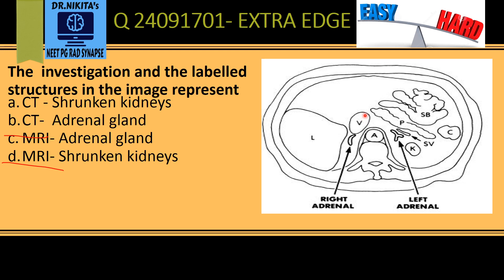To the right of the aorta is the IVC. Just posterior to that is the right adrenal gland, and we have the left adrenal gland here. The adrenal can look like a linear structure like this, or it can have an inverted Y-shaped structure like this.